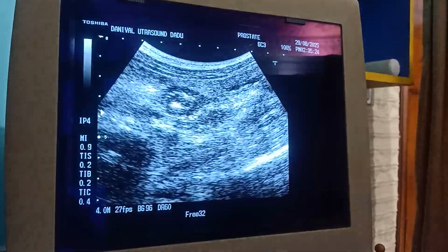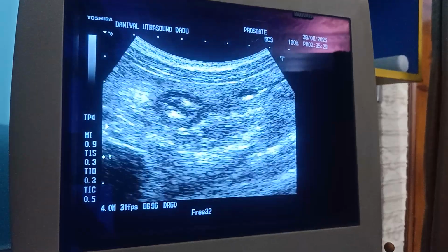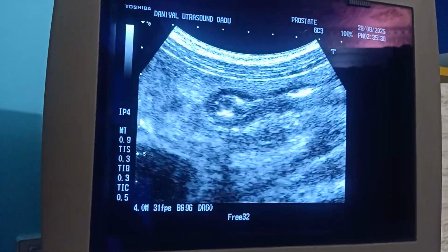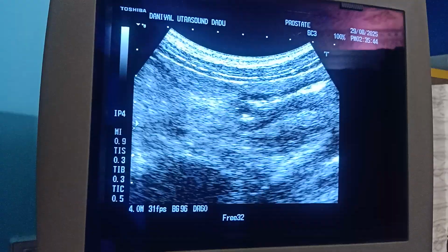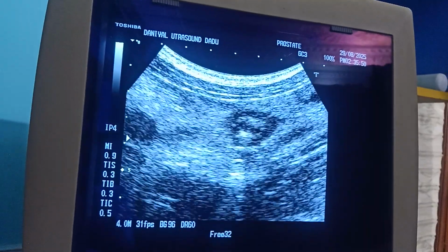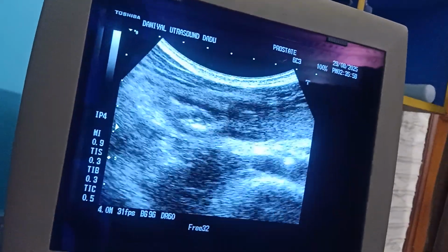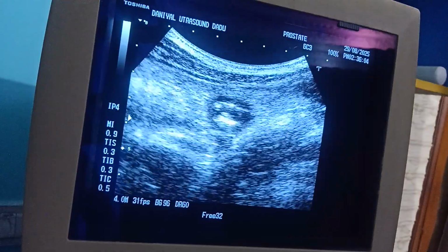This is the transverse view, showing typical gut wall thickening. Now, regarding the reasons, there could be inflammatory causes, infective pathologies, neoplasms, CA guts. Infective, mostly they are tuberculous like Koch's abdomen, and inflammatory maybe ulcerative colitis, Crohn's disease, etc. But the patient has to undergo many other investigations to make a definite diagnosis. My special focus is to show you the pathology.